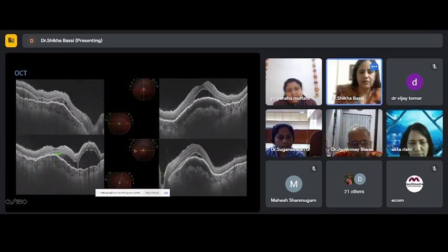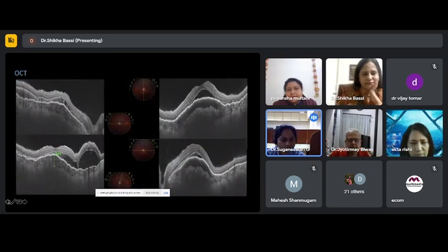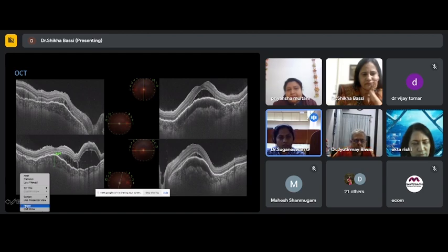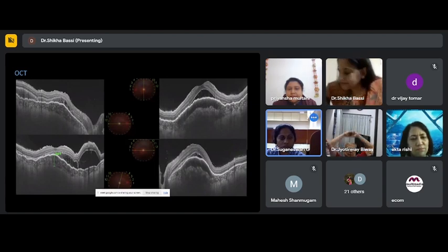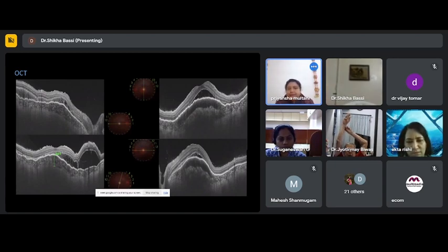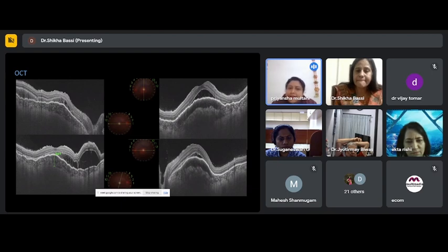Both eyes. Now this is the OCT. Yes, ma'am, stop at this OCT only. So, now Priyansha, in this particular frame of OCT, we are really not able to appreciate the lamellae of the bone, which is supposed to be there in a choroidal osteoma. In the left eye, it looks like a hyperreflectivity within the lesion. This is not something which we see in a choroidal granuloma, say. Like this, in the left eye, we can see an intralesional hyperreflectivity. That wavy thing is there.